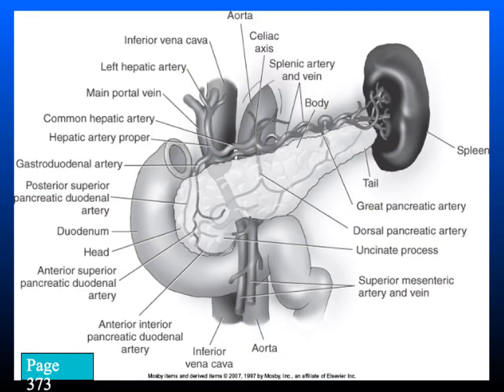This one's really good because next we were going to talk about the spleen, which is located on the posterior left side. It's in a way behind the stomach, and you can see the spleen with or without contrast. You've seen it on CTs, the ones that you see in clinical, and also the ones that we've been seeing together.